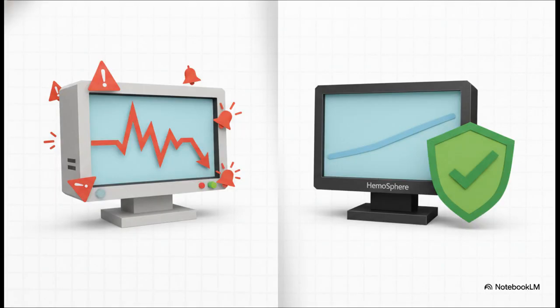The objective here was very straightforward. Could using an HPI-guided protocol actually reduce the amount of intraoperative hypotension? It was a randomized controlled trial. One group got standard reactive care, and the other group was managed using that HPI workflow we just discussed. And the key finding was absolutely compelling. The group managed with HPI guidance had significantly less hypotension. Not just fewer minutes of it, but the events themselves were less severe.